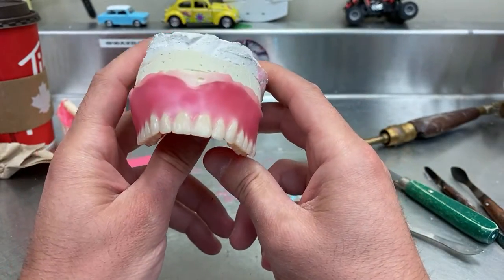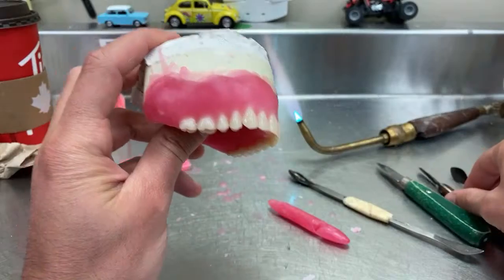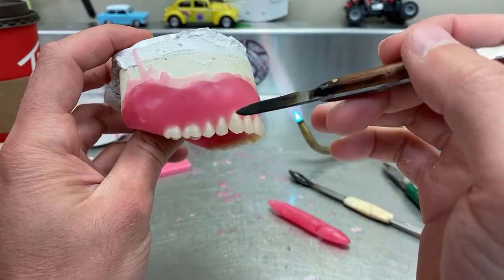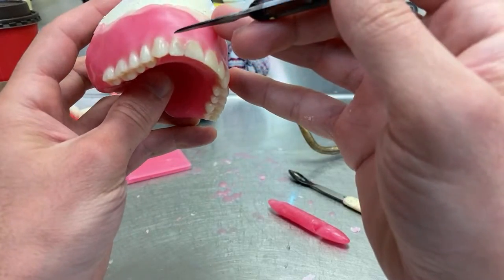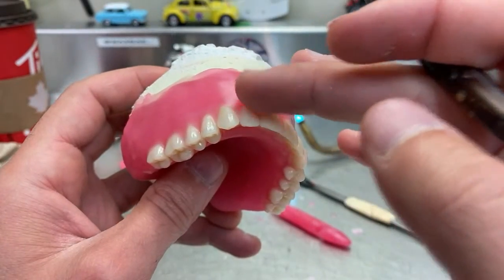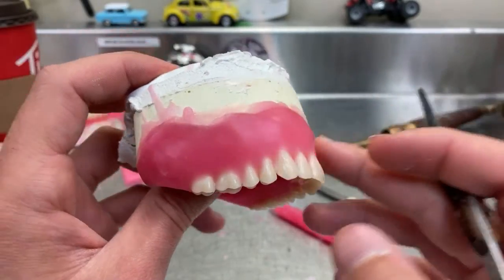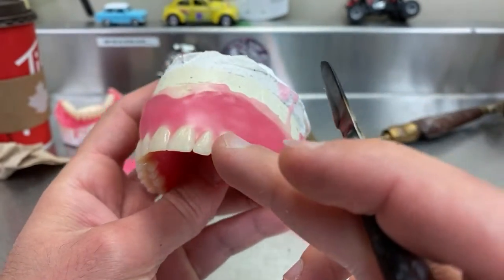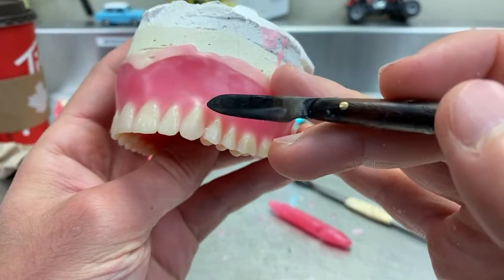So by looking at it, you'll see that most of the necks or the ends of those acrylic teeth are pretty much covered. This one I got about half a mil still buried. This one is almost good, but not good enough, because you can see it's sticking out further than the gum, and you don't want that because that will give it an unhealthy look. This one is kind of okay. This one needs a touch, and then this one here is actually pretty exposed.